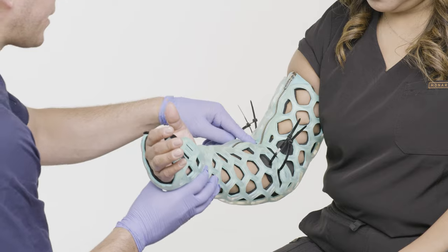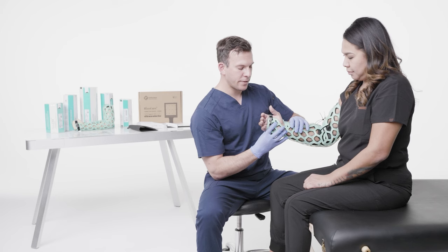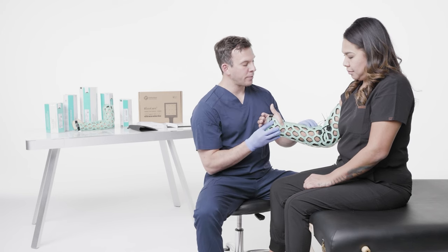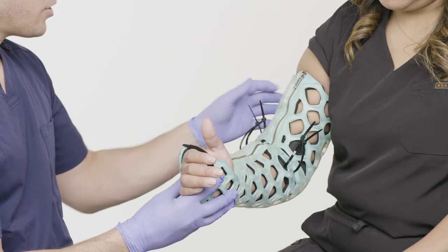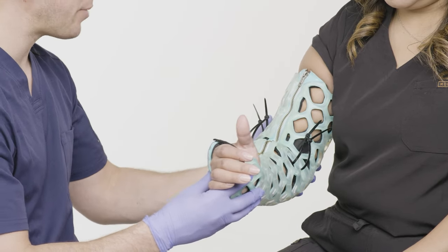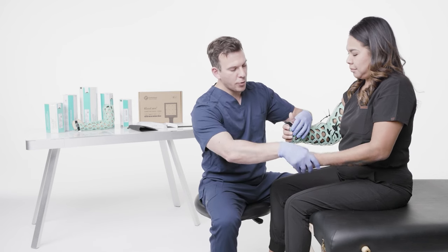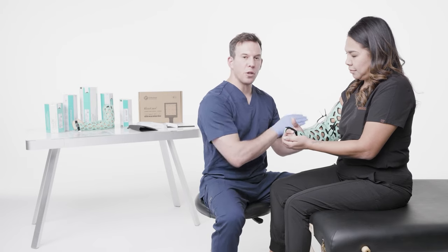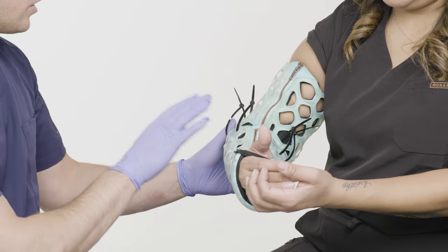Zipper is straight, not folded under. Zipper is folded up on the distal and proximal ends. We're going to make sure we have slight wrist extension — remember, 10 to 15 degrees of wrist extension. At this point, your patient might start having concerns about their arm being tired from holding this position for a couple of minutes. You can take your patient's uninjured hand and just apply it there to take a little bit of pressure off that upper arm and bicep so their arm can relax.